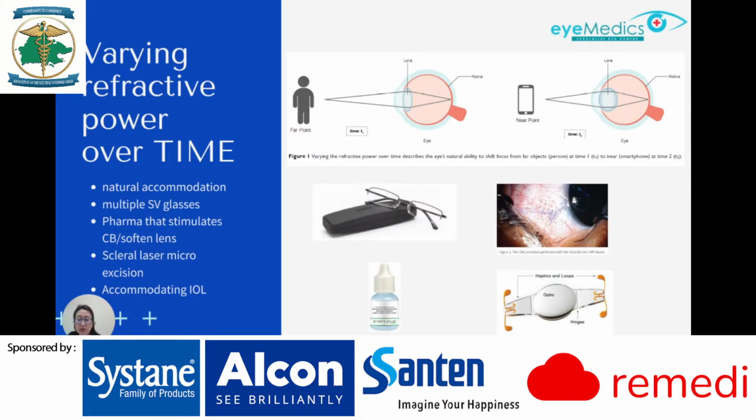Last will be accommodating intraocular lens, which are intended to create a progressive change in power in relation to active contraction of the ciliary body. The disadvantage of this method is that, at the moment, no drug or device demonstrating true refractive change over time has received approval from the US FDA.